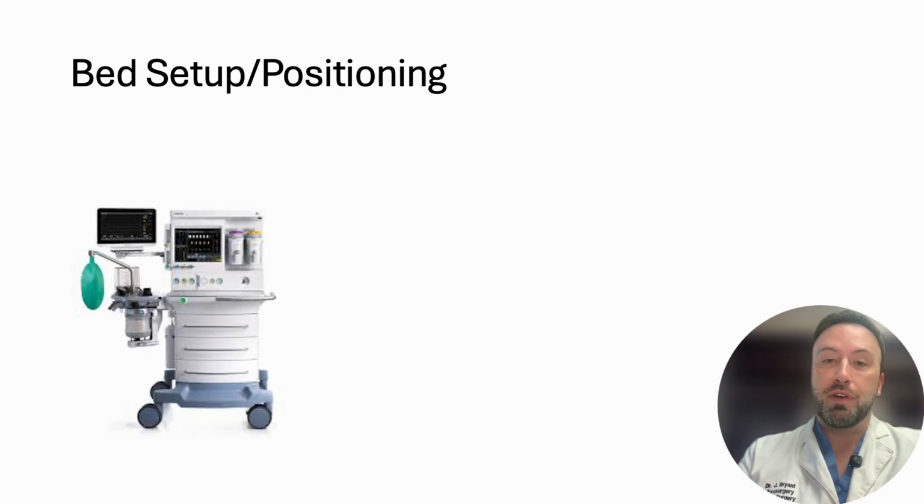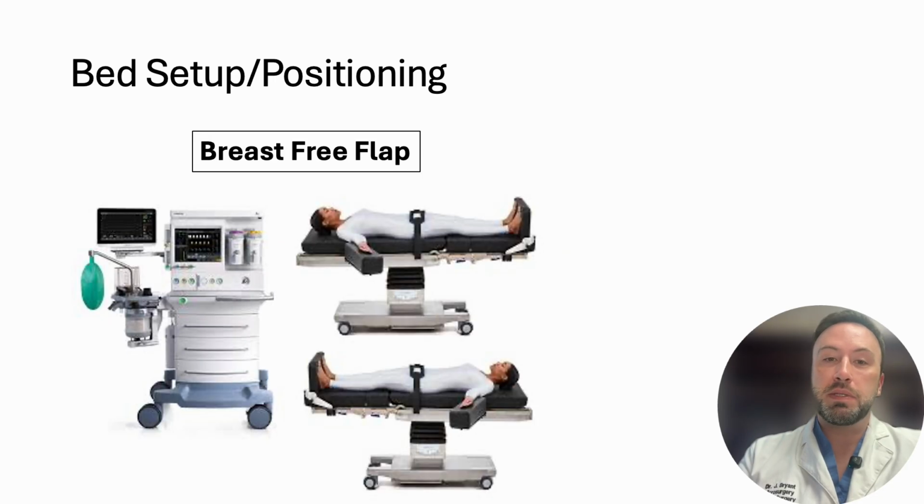For breast free flaps, the OR table position is surgeon dependent. It may be either in the normal position with the head toward the anesthesia machine or positioned with the foot of the bed toward the anesthesia machine.